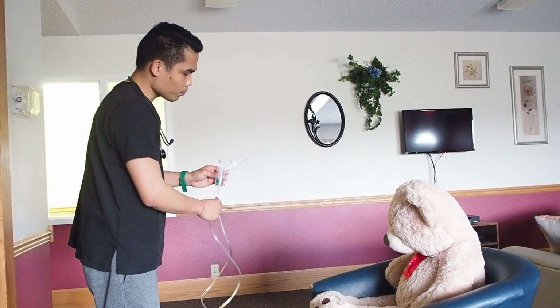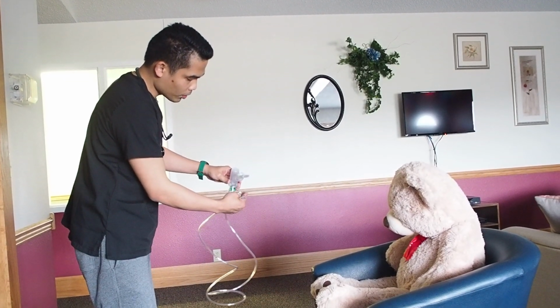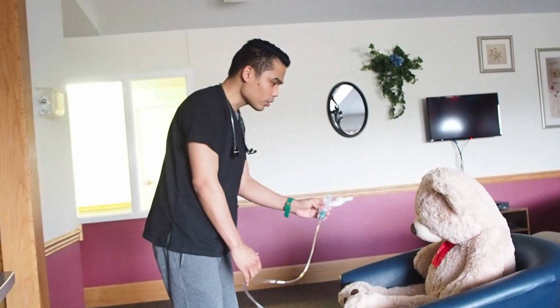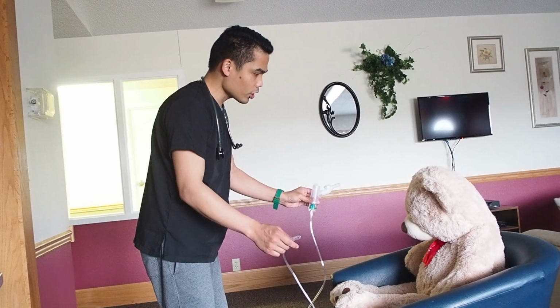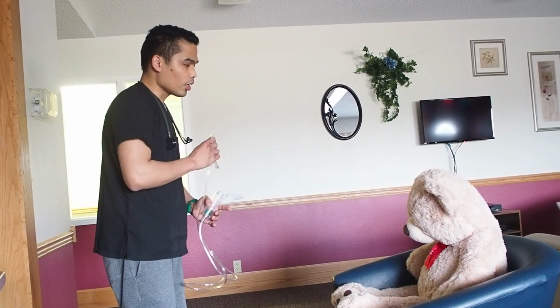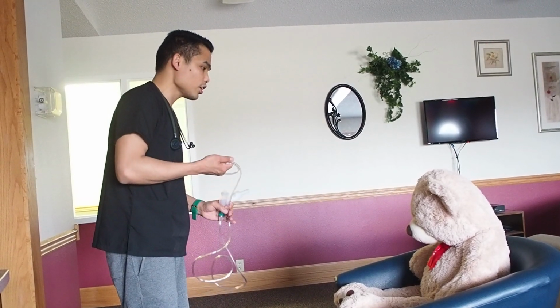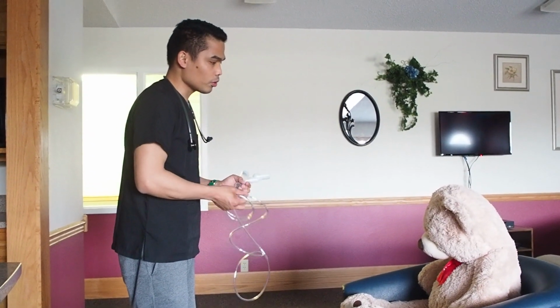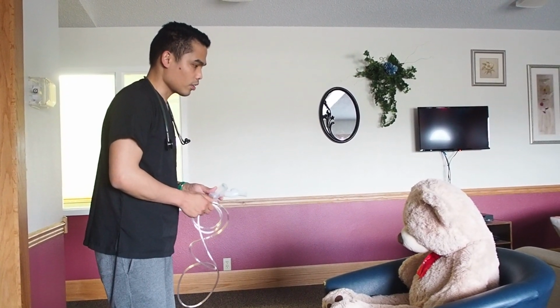So what we're going to do is put this inside your mouth with your lips sealed, and don't forget that your tongue should be below. Do not obstruct it inside. Okay? And then once it's inside your mouth, you have to do normal breathing. Just relax, and also do occasional deep breathing. The reason why we're giving this is because, as we have seen in your chart, there were some infiltrates in your x-ray, and as I was listening to your lungs, there were also some secretions. So it would help mobilize your secretions in order for you to breathe more comfortably. Okay, so shall we start?